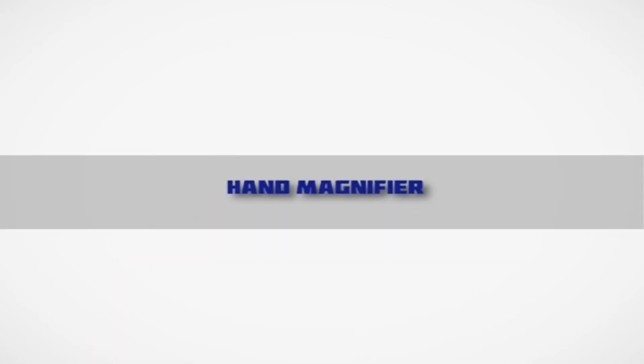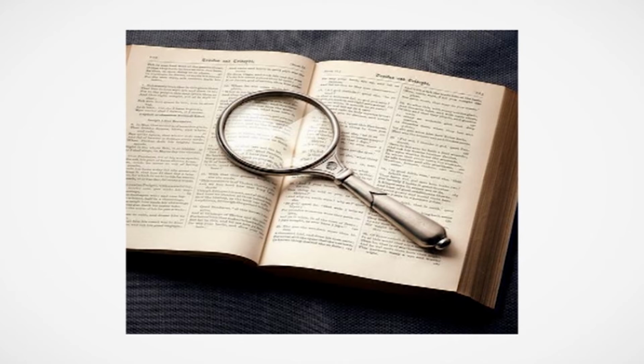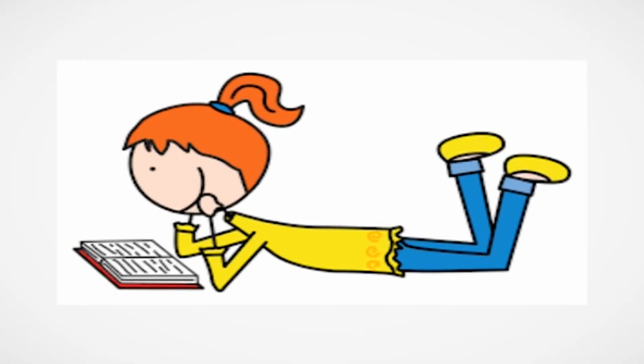Hand magnifier. Place the magnifier at the top of the page at the start of the paragraph. Ease it slowly towards the eyes till the point is reached where the letters are clearest. Move the head to the best position above the magnifier. Try out a comfortable position. Move the magnifier slowly from left to right while reading, keeping the same distance between page and magnifier. When at the end of the line, move back across the same line to the beginning. Move down one line and start reading again.